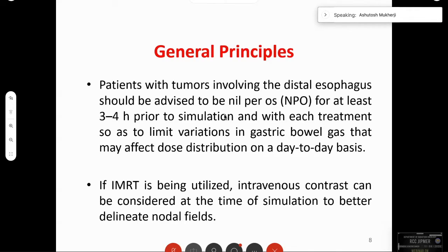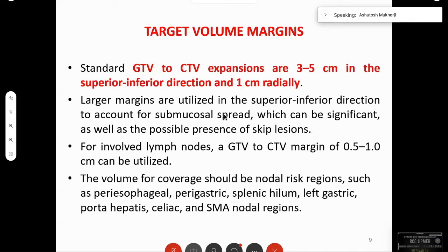Oral contrast is used for the mucosal extent and IV contrast helps delineate the nodal fields. The standard GTV to CTV expansions are 3 to 5 cm in the superior-inferior direction — it used to be 5 cm in the era of 2D RT, went down to 3 cm with 3D CRT, and was tried to be brought down to 1 to 1.5 cm with the advent of PET-based planning. However, results are divided; it is still safer to take at least 2 to 3 cm margins superiorly and inferiorly, and at least 0.5 to 1 cm radial margin.